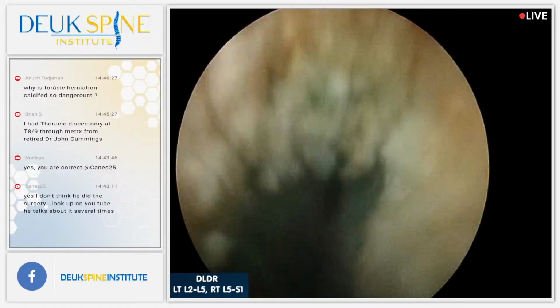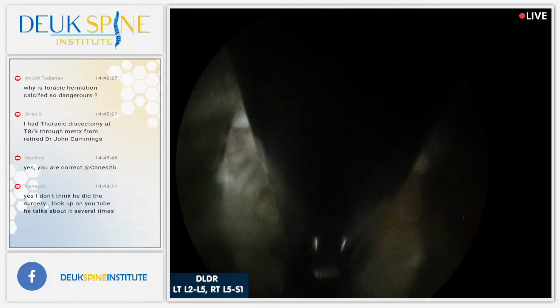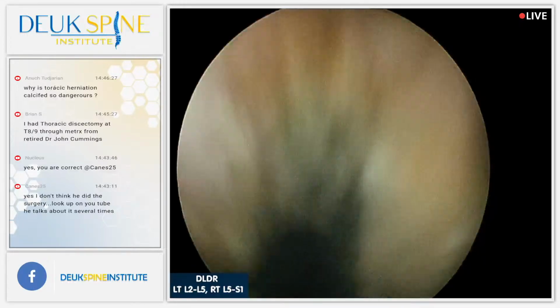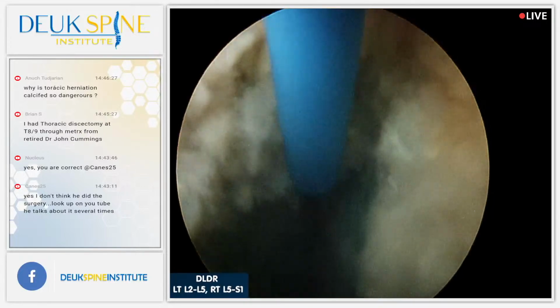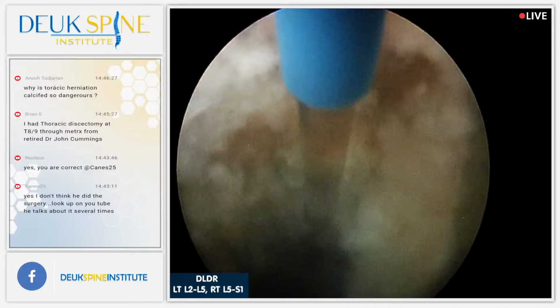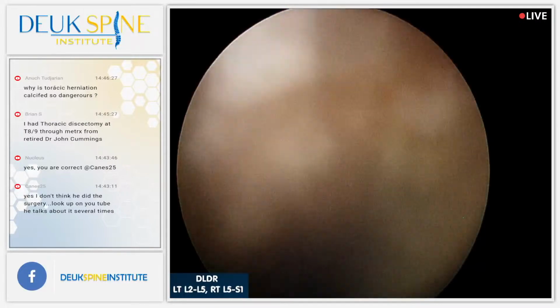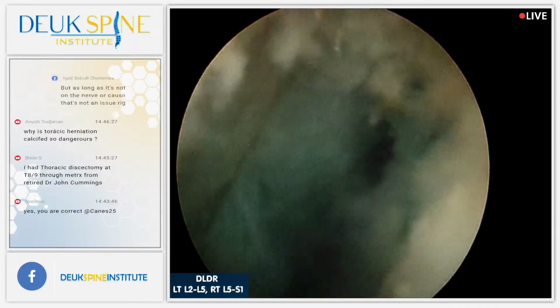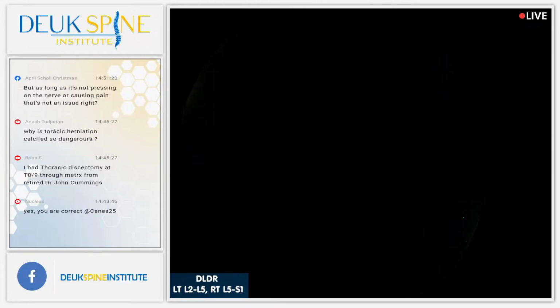All right. Let's do one more grab. Just about done. That's about all I can do. That's just a wad of scar tissue at the back. And I'm debulking it, meaning I'm getting the most of it out. But probably got 60%. And that should be enough to get rid of his symptoms. All right, we are done. Lights on, we're done.